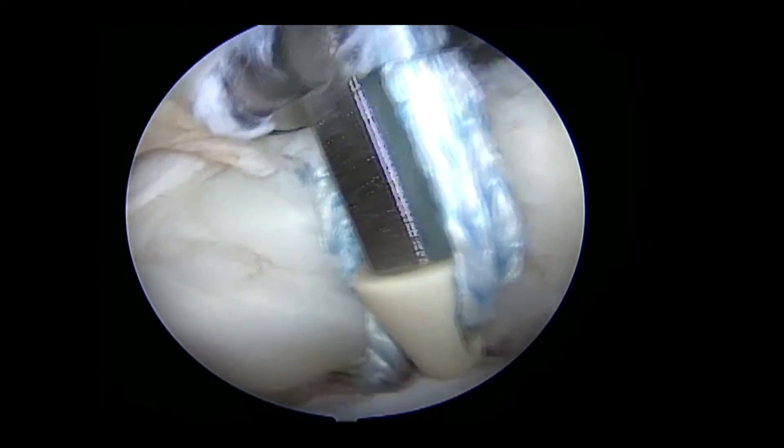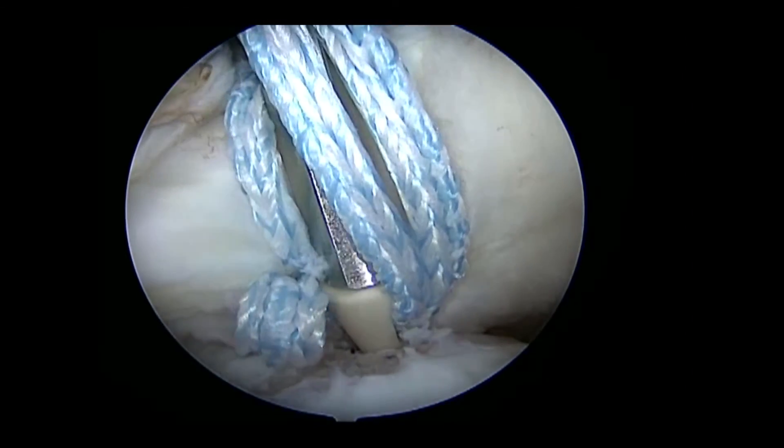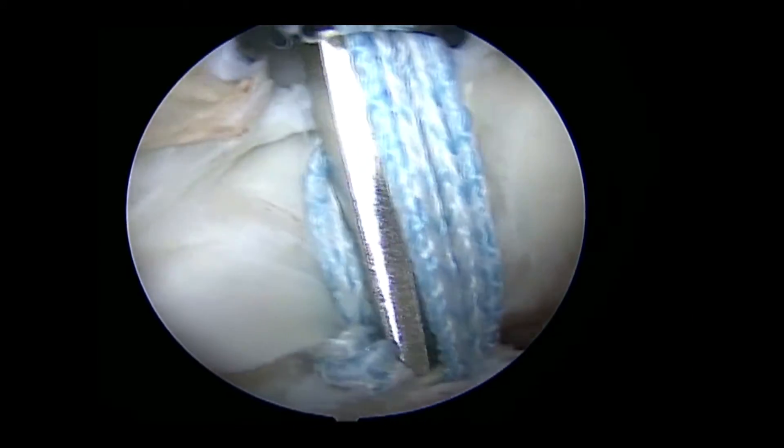The fiber tape sutures are tensioned to pull the subscapularis into the reverse Hill-Sax lesion, filling the void that was previously present.